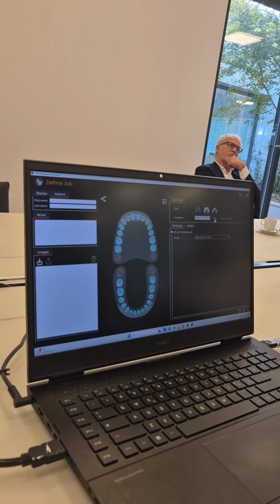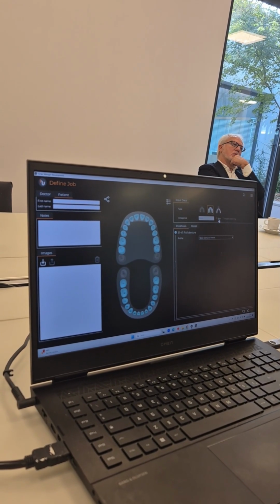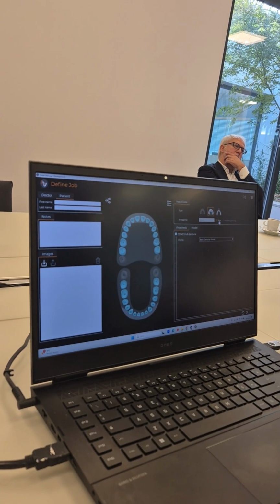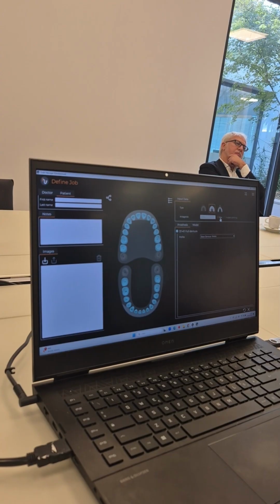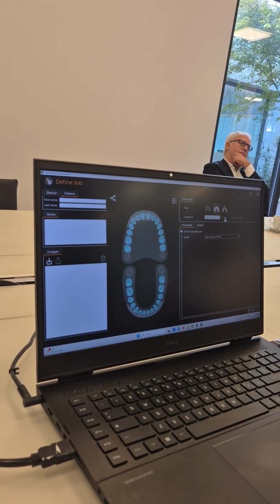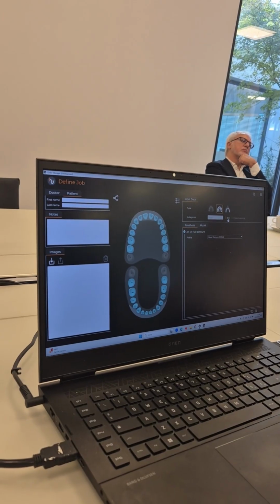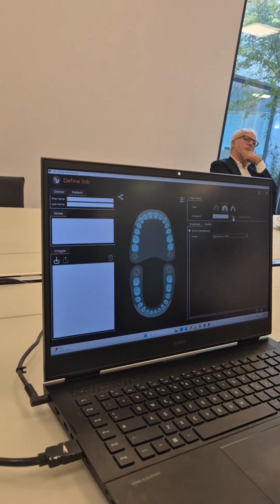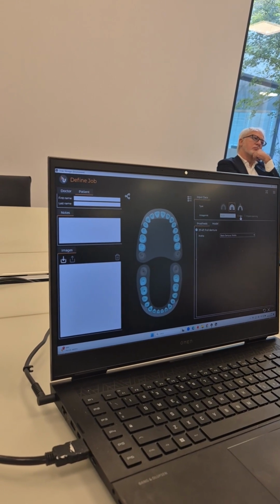And what I mean is that there are 3 different classes, no? Maybe people who want to print don't have the knowledge to adjust. My question is, is it possible to have a preset, for example class 1, 2, 3, and automatically there is a preset that is perfect for this criteria?